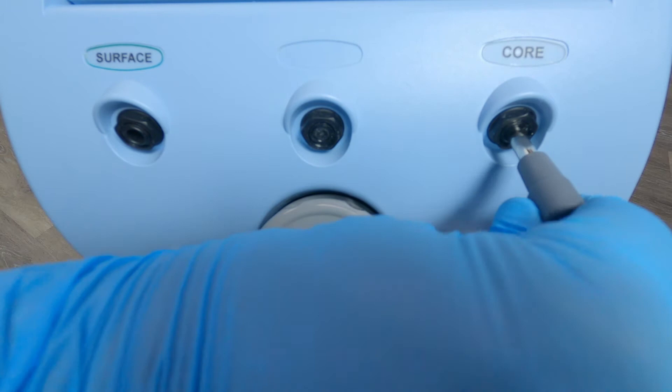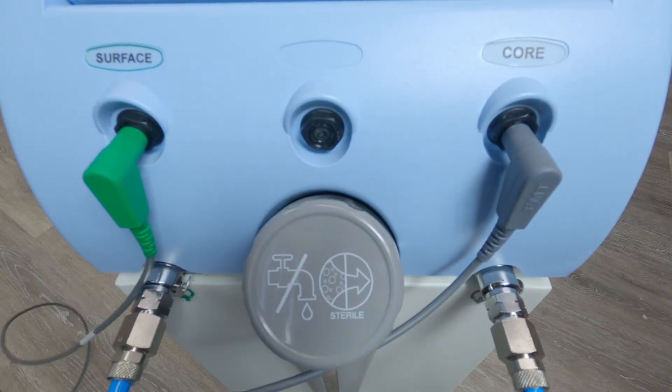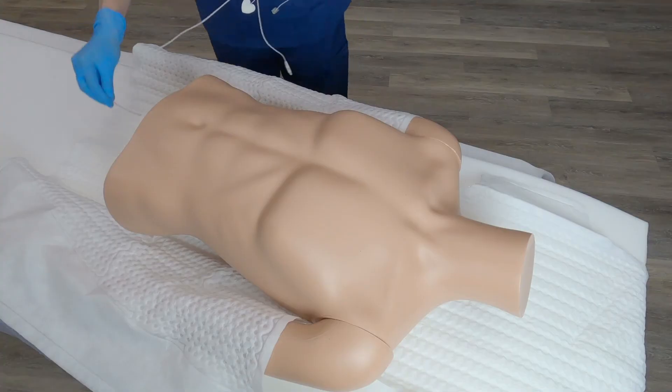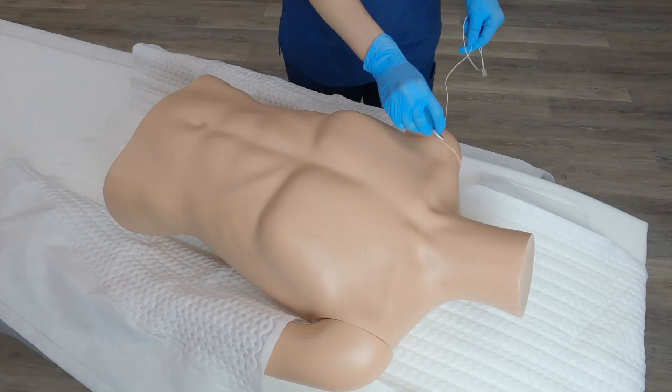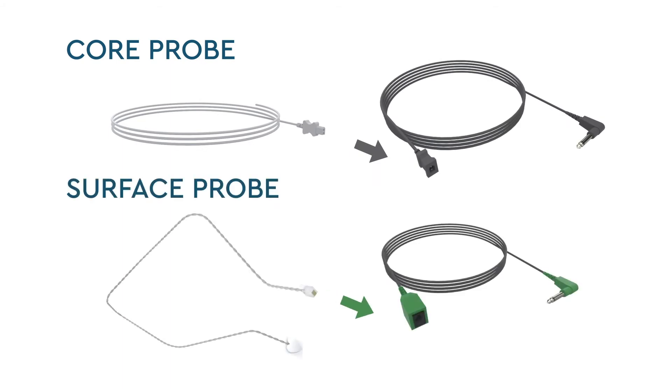Connect the temperature adapter cables or probes to the device, matching colors: gray for core, green for surface. Connect the probes to the patient and to the adapter cable if using a disposable temperature probe.